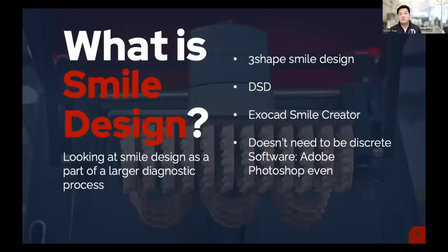So when it comes to smile design, you have a whole host of different software packages that you can use today. So you have 3Shape Smile Design, DSD, exocad Smile Creator. You can even use Photoshop. It doesn't need to be a dental specific program. You can even use MS Paint that comes with your computer, as long as you're skilled enough and you know how to do it.